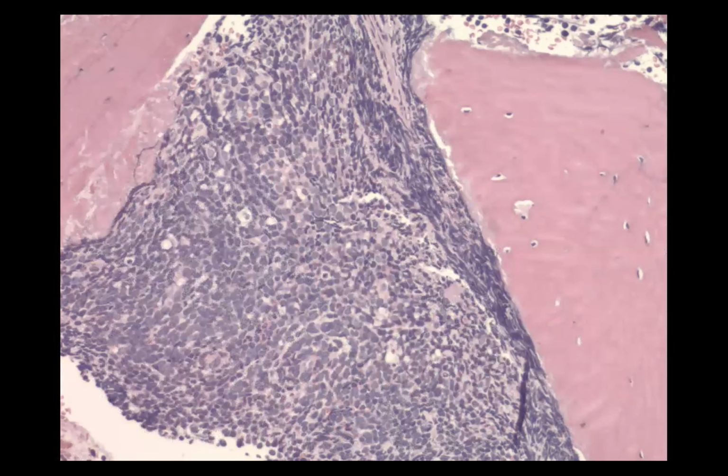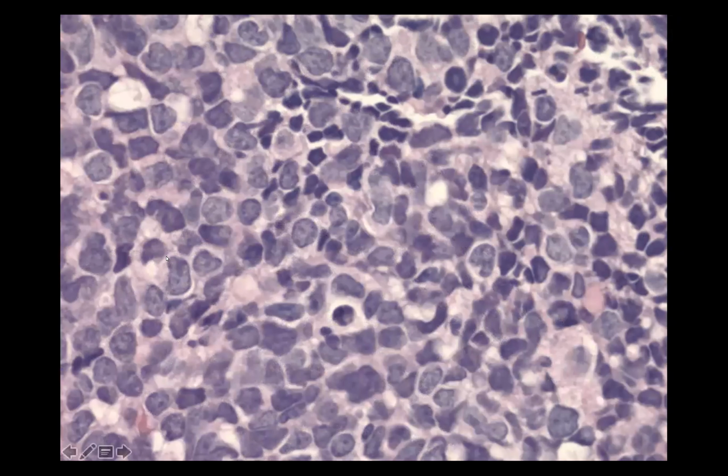You don't see the trilineage hematopoiesis, which means you should see megakaryocytes, erythroids, and myeloids. Here, it's just one type of cell. It's a large cell with irregular nuclear membrane. The chromatin is pale or open, and sometimes you see prominent nucleoli. So these are all blasts. These are sheets of blasts. And then the next step is to do the markers by IHC and flow to see what type of blasts they are.